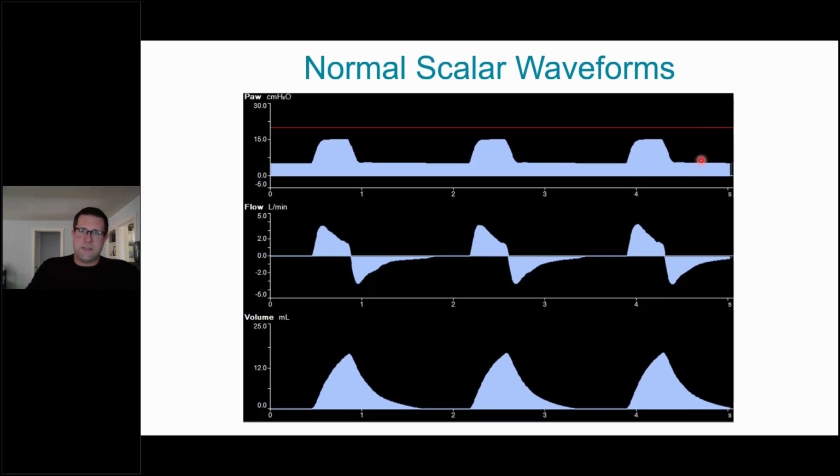And I would say in the NICU, we always use pretty much a decelerating waveform pattern. We'll use pressure control, or we'll use volume targeted mechanical ventilation. And so for a single breath, we have this increase in pressure. Start a breath. It's how many, how much, and how long, right? So basically how long we hold in that breath in the lung, that's determined by the inspiratory time.